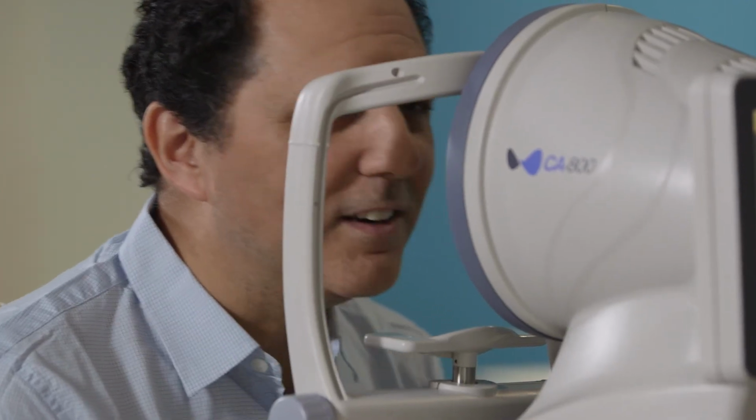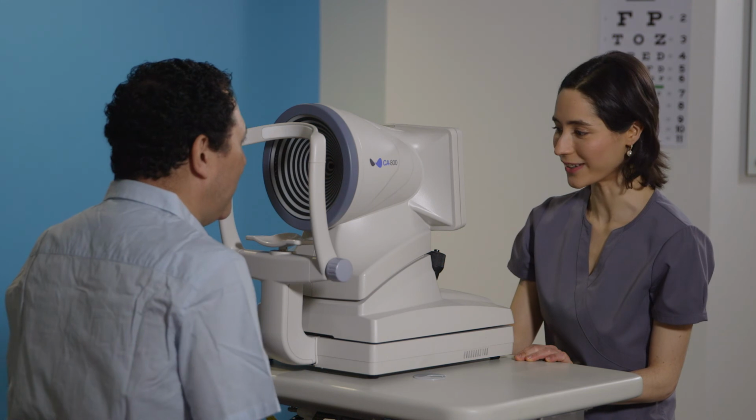CA-800 is your easy-to-use corneal topography and dry eye workstation.